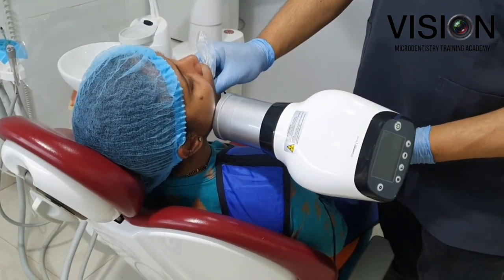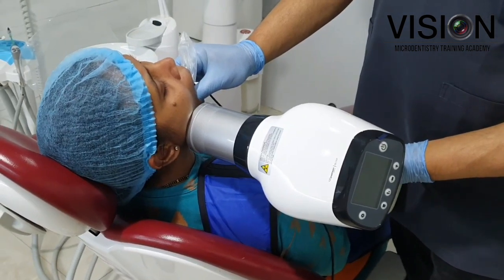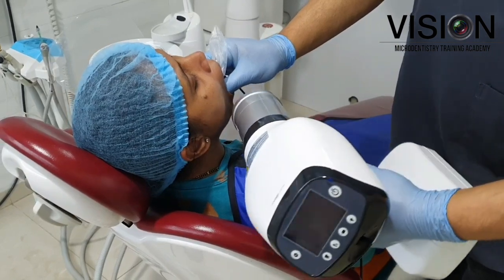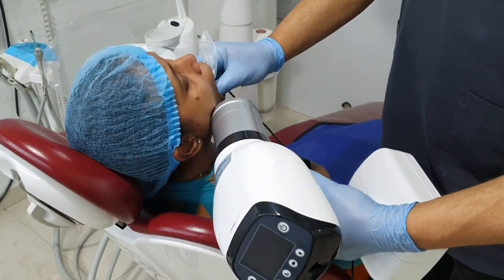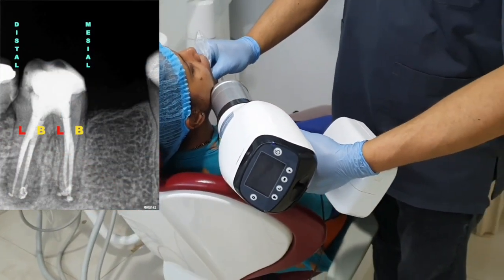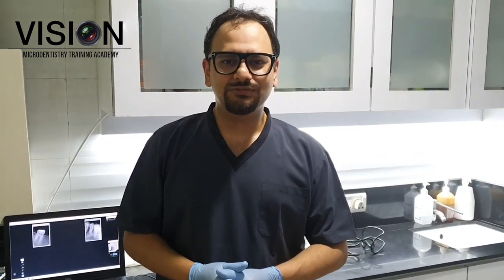So if I had to take a head-on X-ray, I would place my sensor inside and the X-ray tube would be placed perpendicular to it. When I say distal shift, that means I will shift the head of the X-ray unit towards the distal and the cone will be directed towards the opposite, mesial side. This is the position I would use for lower molars with multiple canals. I hope this video was useful and the clinical tips on taking better dental digital radiographs were helpful. Thank you and have a good day.